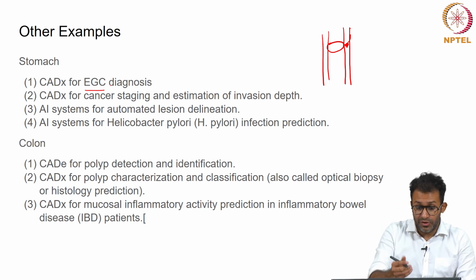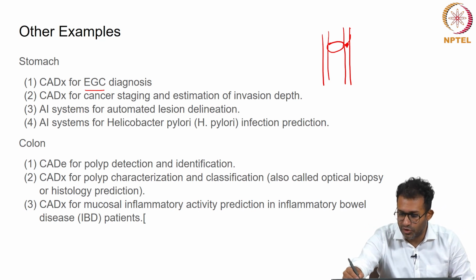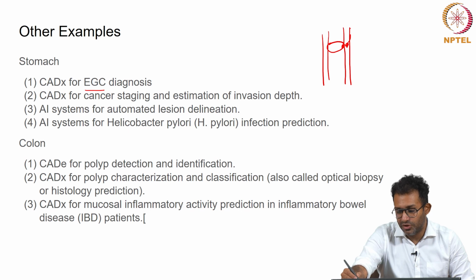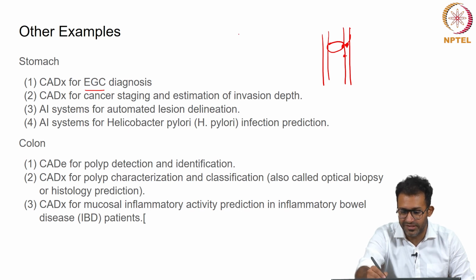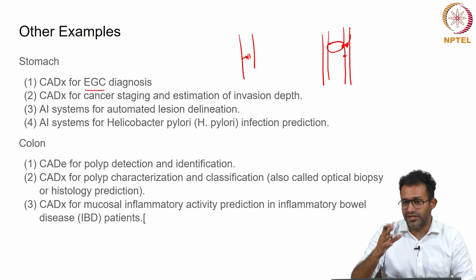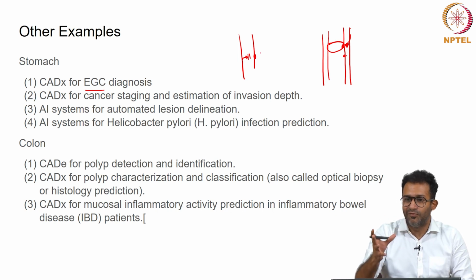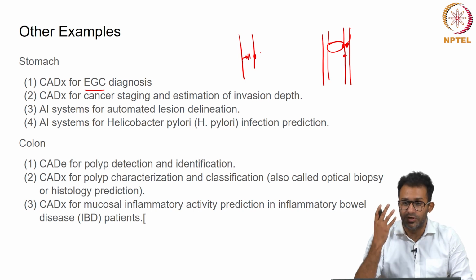It can be used for cancer staging and estimation of invasion depth. Many times you put an endoscopy, you see the cancer over there, but you don't know how deep inside it has gone. So, you have a cancer over here, you don't know how much inside it has gone into the surface. So, this helps us in staging the disease. So, if it has reached over there, you can say that it has become a T4 lesion or sometimes a stage 4 lesion, and the patient may have a poor survival.